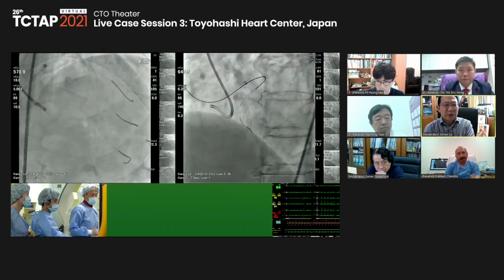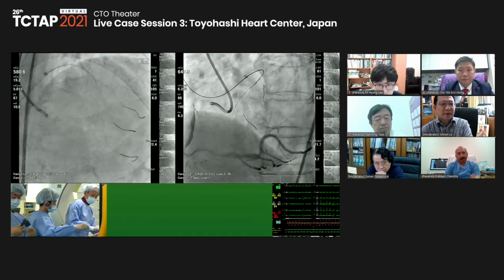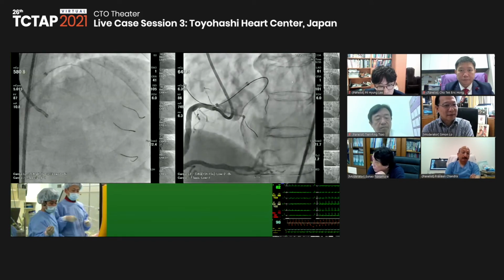So Dr. Nasu, you're going to balloon the LAD first? Yes, of course. From now on, I will use the 2.0 balloon anyway, and then check the IVUS and escalate the balloon size or something.